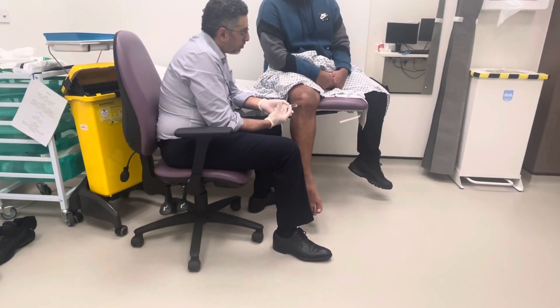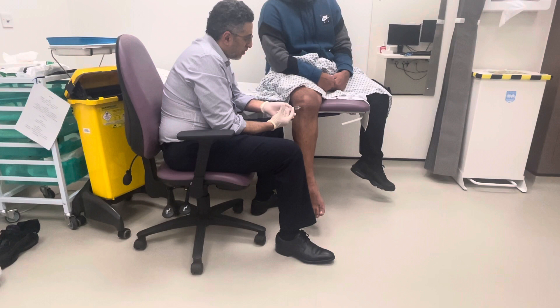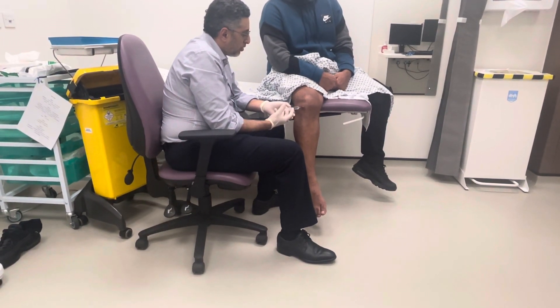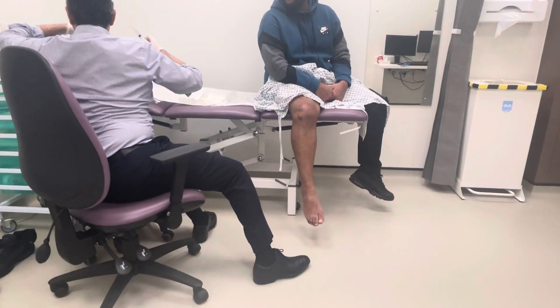That's good — it should feel funny. Feeling pressure now? So a few mils there, that's all you need. It will numb now and there's a smooth block there. The second thing I'm going to do is give the steroid injection.